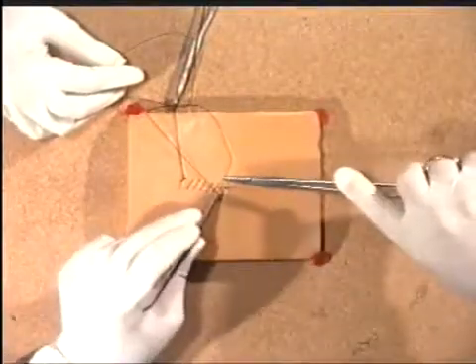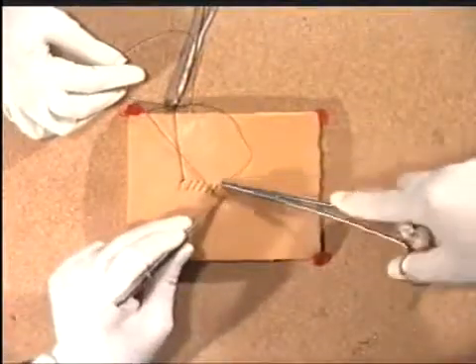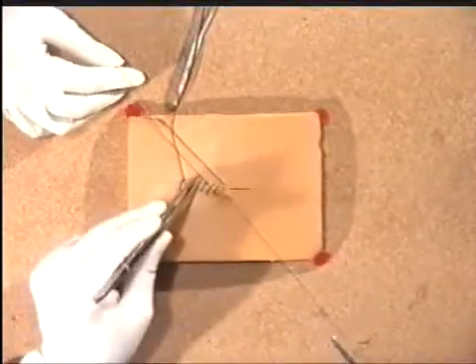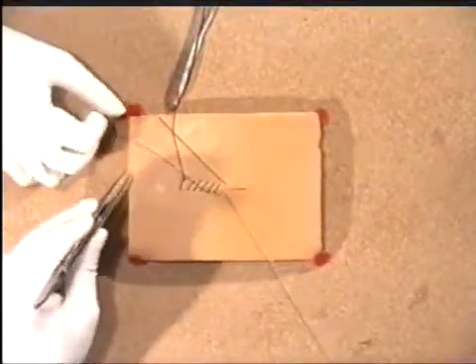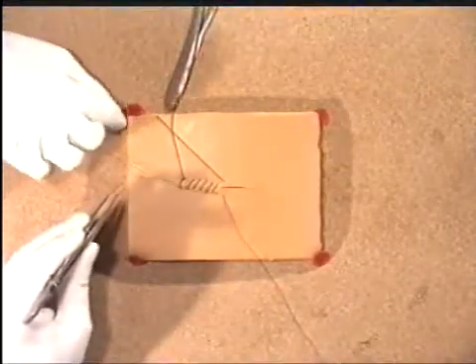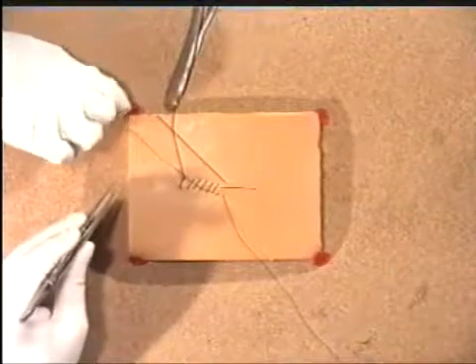Unfortunately, in this case, the assistant was not alert and allowed the suture material to twist around an instrument. It now becomes increasingly difficult to untwist this, and panic sets in.